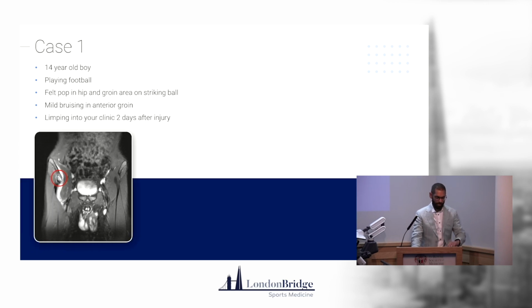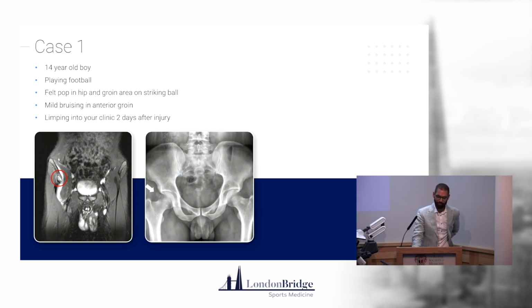Right, I realise I've run out of time, but I was going to finish with a couple of case studies. So, a 14-year-old boy playing football, felt a pop in the hip and groin area on striking the ball, had some bruising around the front of the groin. He came into your clinic 2 days later. Before that MRI came up, what investigation would you choose? There's no wrong or right answer here, by the way.